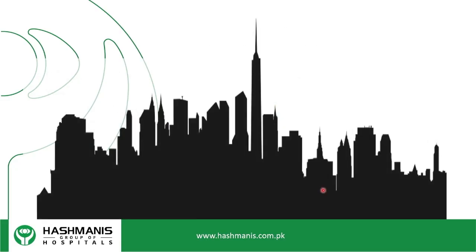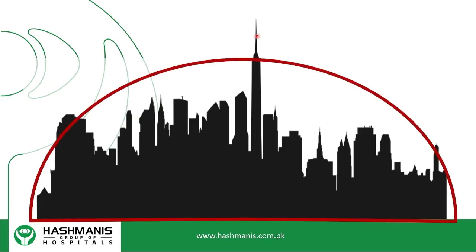So just as an example, I personally use best fit sphere. So what happens is if you've got a city like this and you've got these buildings, but you've got this one building that goes very high, the reference surface will come as an average to all of this, right? But then another enhancement in the Pentacam or many machines now is that a lot of the keratoconuses are now hidden, because that one outlier data is actually pulling your best fit sphere higher, and because it's pulling it higher, the cone becomes hidden.